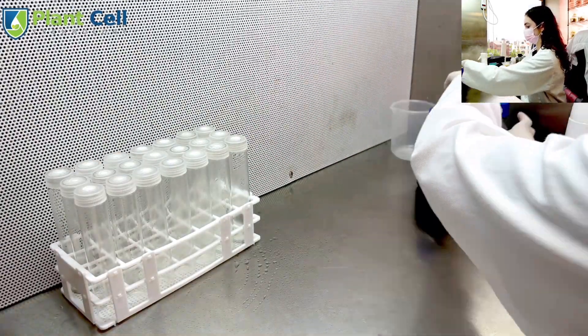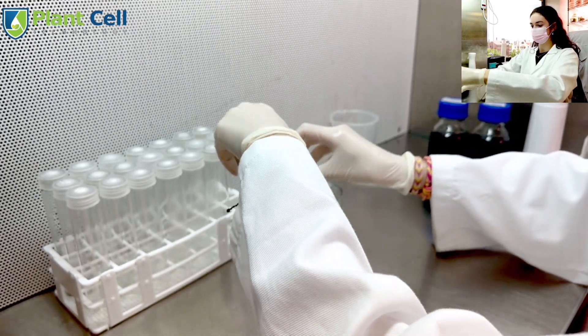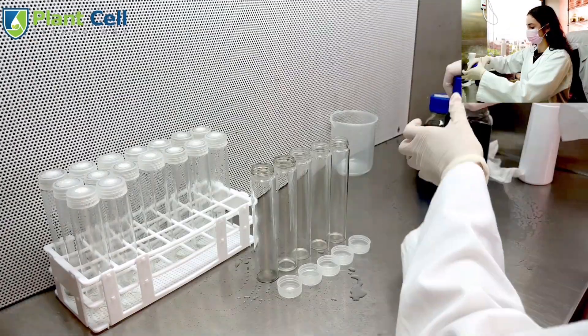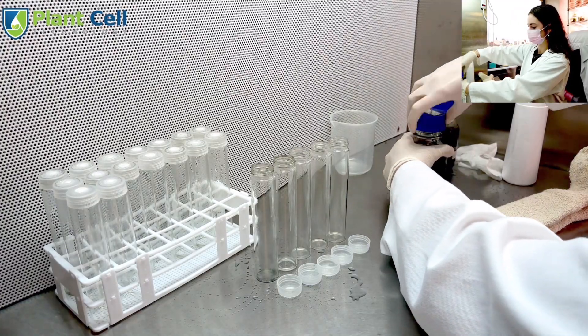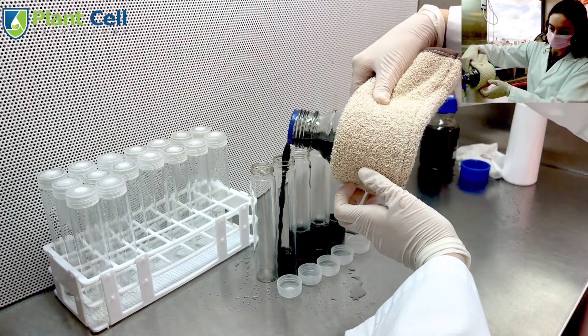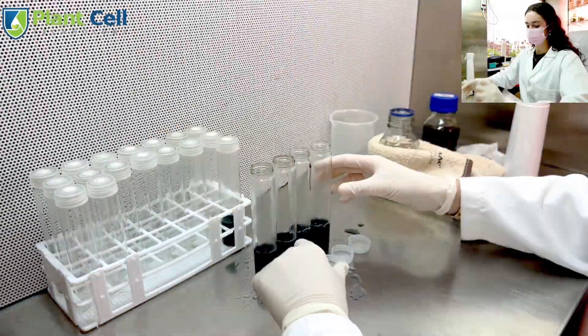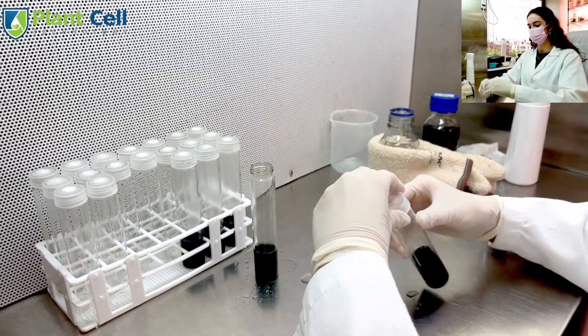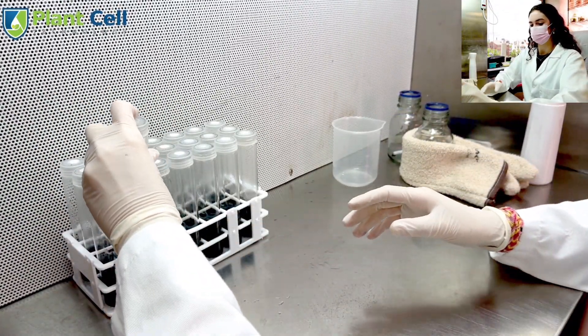Re-sterilize the workspace, including the test tubes and media containers. I chose to pour the media 5 test tubes at a time, and make sure to shake the media container before pouring because some charcoal may have stuck to the bottom of the glass. Repeat this process for all 21 test tubes, and make sure to shake the media container before each pour to agitate the charcoal.